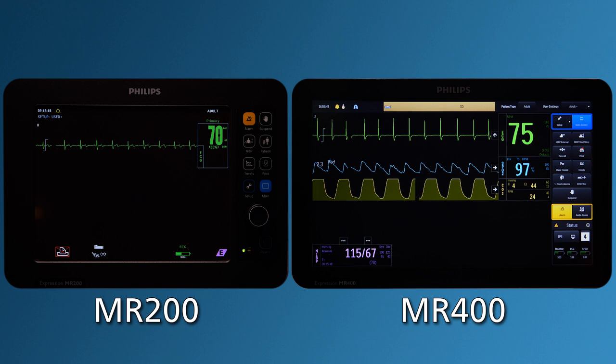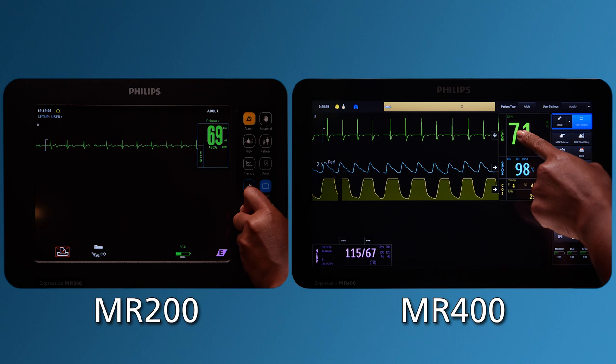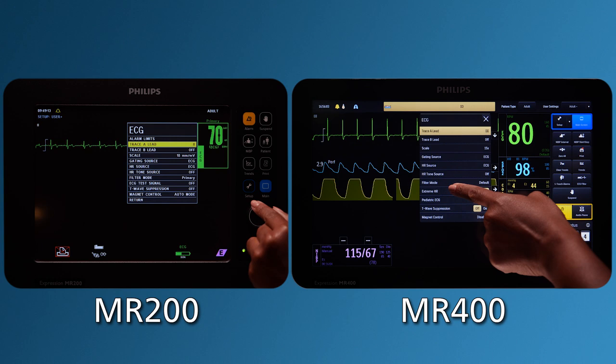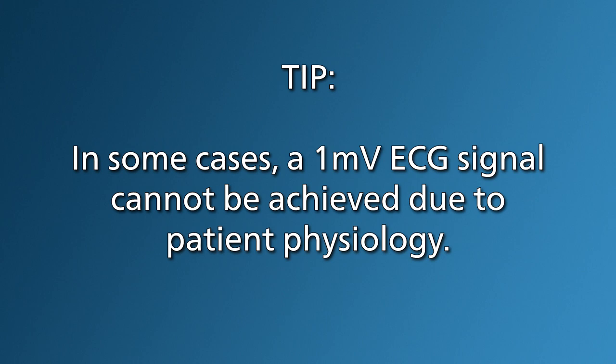If you prep the patient's skin and place the electrodes correctly but are still not getting a 1 millivolt ECG signal, attempt to change the lead view. Lead 2 is the default lead. Cycle through the additional lead views available until a 1 millivolt signal amplitude is obtained. Tip: in some cases, a 1 millivolt ECG signal cannot be achieved due to patient physiology.